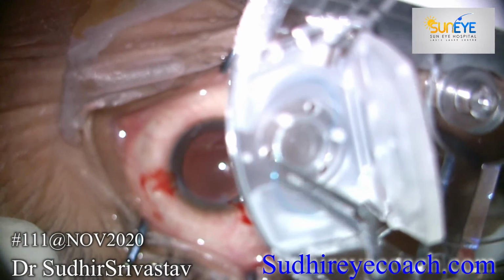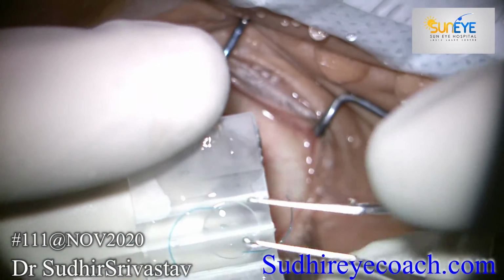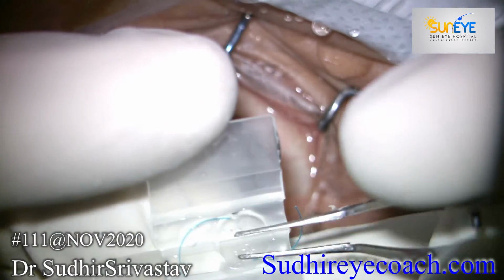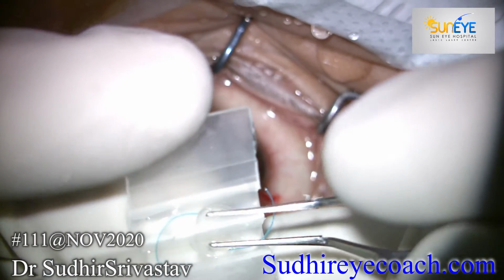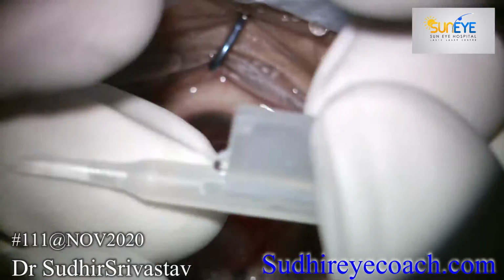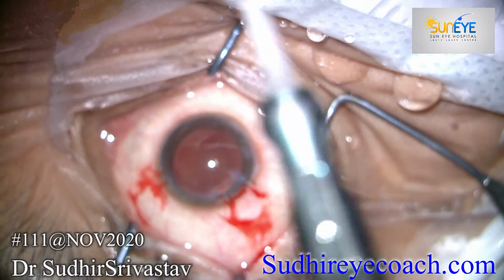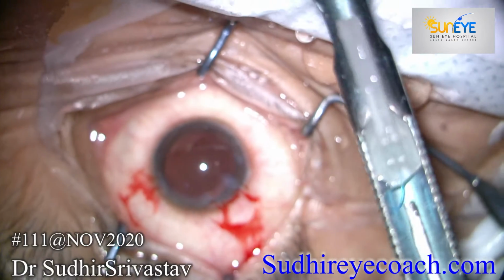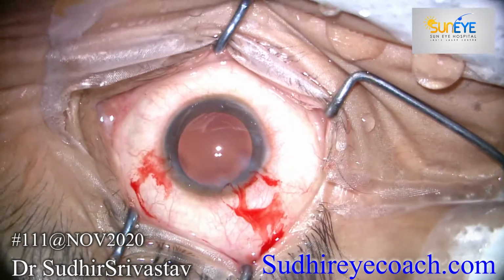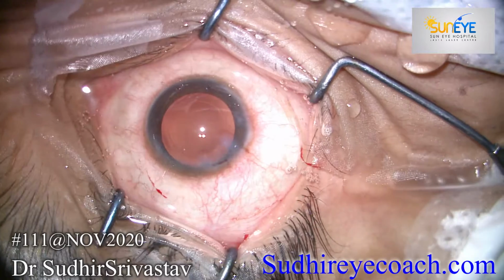For IOL power calculation, we used the IOLMaster 700 and the Barrett Universal formula. The power of the IOL came around -3.5 diopters, so we selected a multi-piece hydrophobic IOL for implantation. Loading and implantation of a multi-piece IOL is always tricky, and one should master implanting these IOLs. I call them rescue IOLs, and I always keep an inventory of such IOLs in my OR.